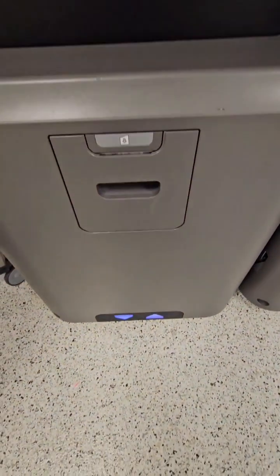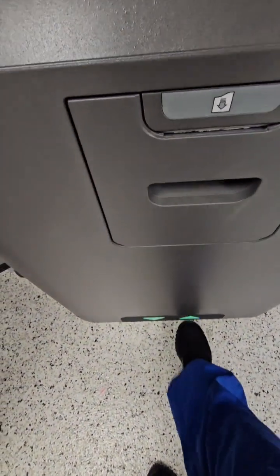Two ways to open the door — you can do it on screen, or you can use this kick plate. If you're a little stressed, use the kick plate. It's kind of fun to do.